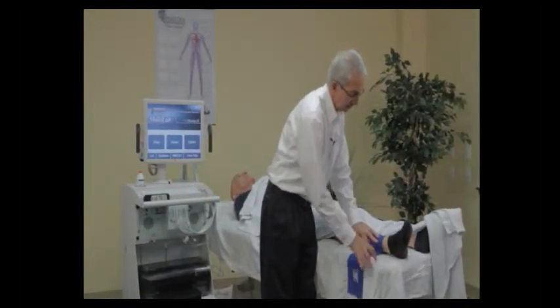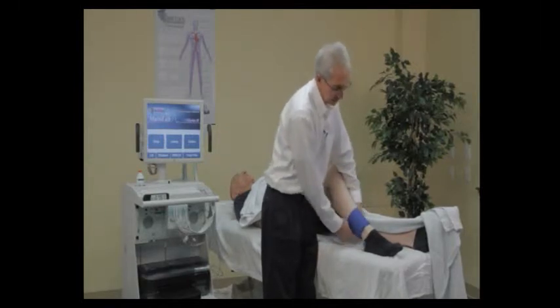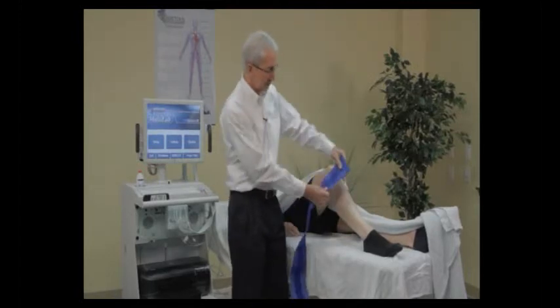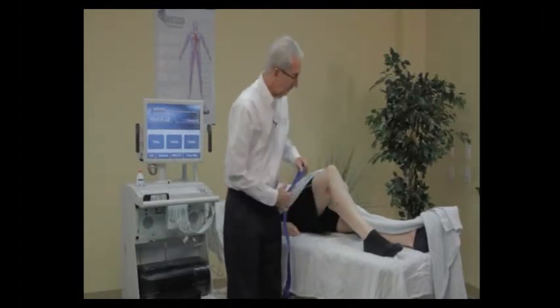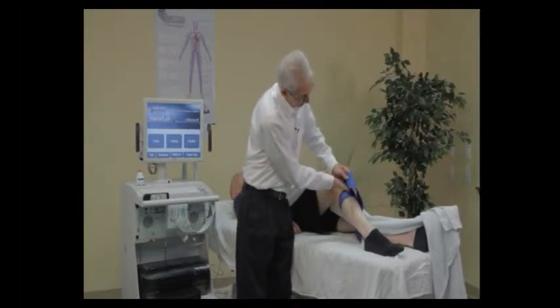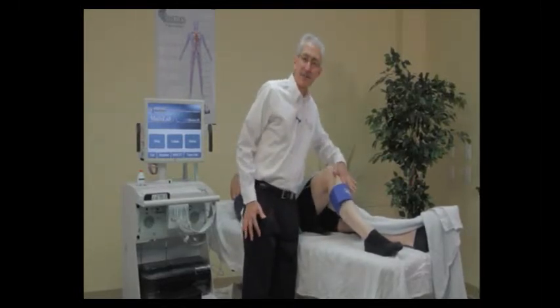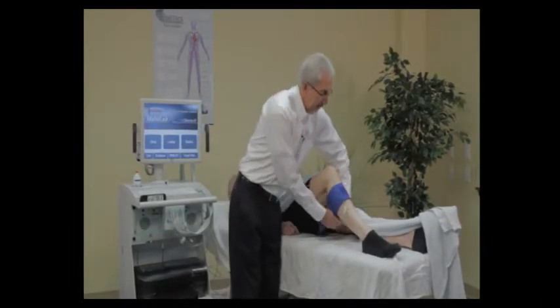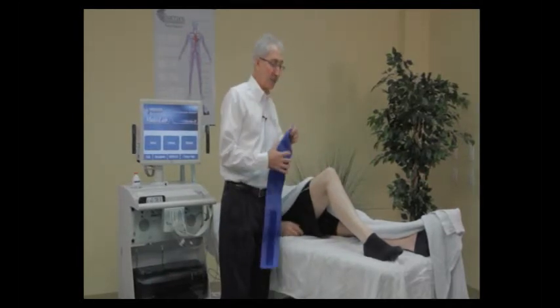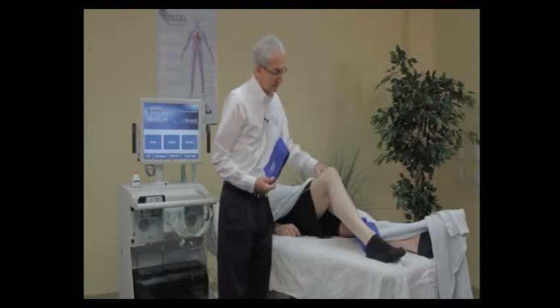A nice technique if you're struggling is to have the patient bend their knee and balance with their foot. When applying the calf cuff, you want it over the maximum circumference of the calf muscle — don't put it right below the knee or at mid-shin on the bone. Apply snugly. The rule of thumb is you should be able to get one finger in the cuff from the top — you don't want to over-tighten. For cuffs above the knee in the four-cuff method, make sure there's space between both cuffs. You have a lot of fleshy tissue there and the inlet hose will not pinch the patient.